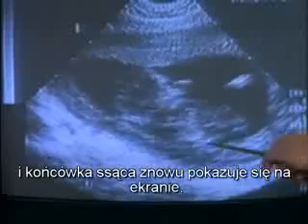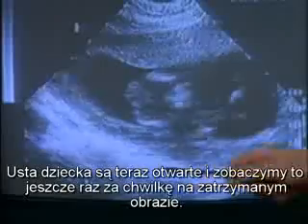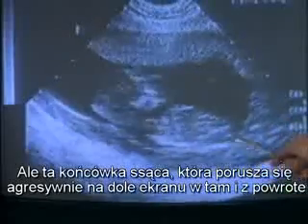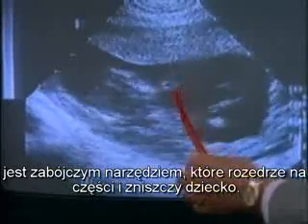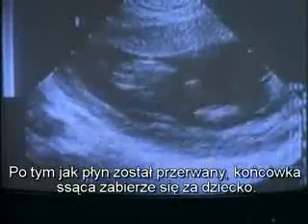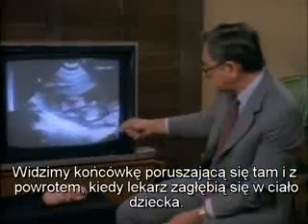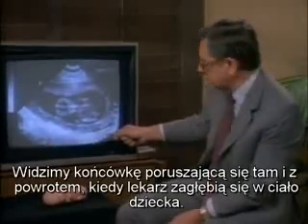The child's mouth is now open, and we will see that again on a freeze frame in a moment. But this suction tip, which you can see moving violently back and forth on the bottom of the screen, is the lethal instrument which will ultimately tear apart and destroy the child. It is only after the fluid has been broken, the sac has been disrupted, that the tip will actually come against the child. But we can see the tip moving back and forth as the abortionist seeks the child's body.